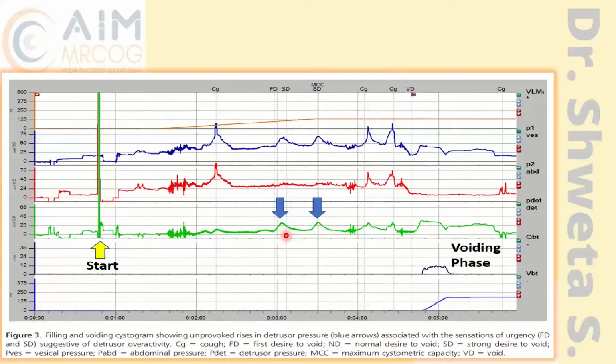Never make it stress. For stress to diagnose, there shouldn't be any detrusor activity. That is the mandatory definition, which I will show you in a further slide. So see first the detrusor and make your diagnosis. If detrusor overactivity, the diagnosis always is detrusor overactivity, either provoked or unprovoked, either with incontinence or without incontinence.